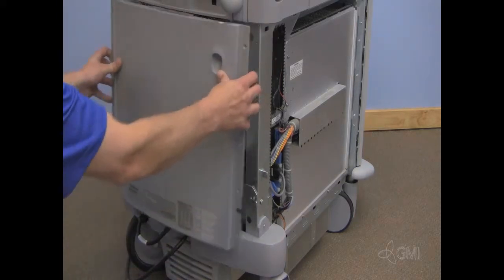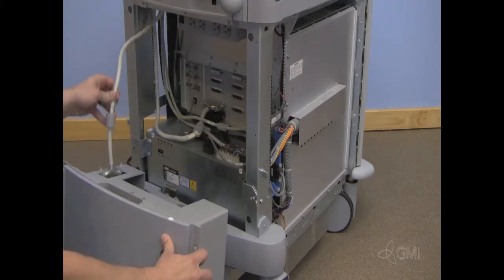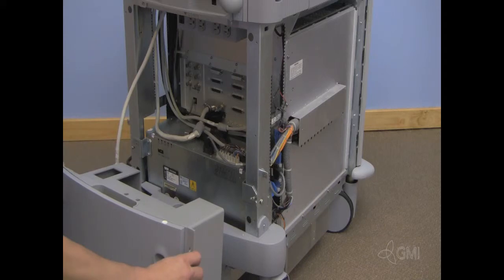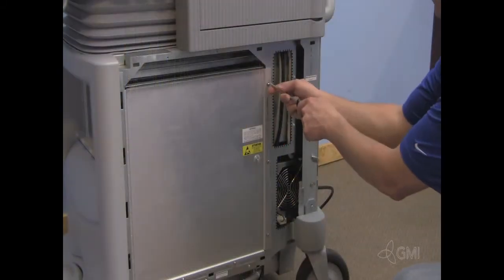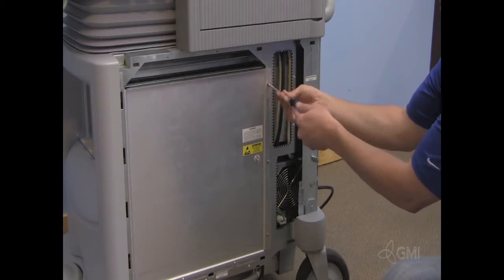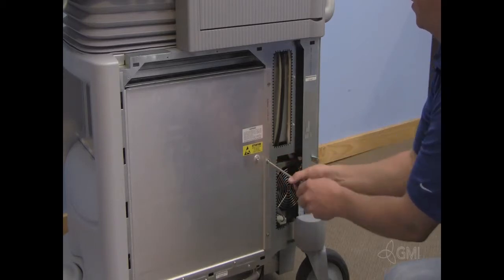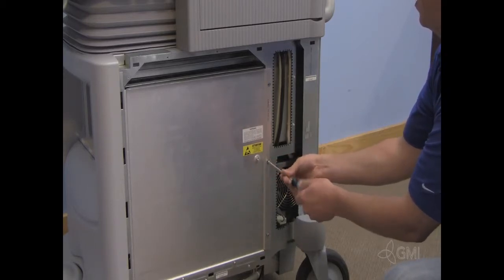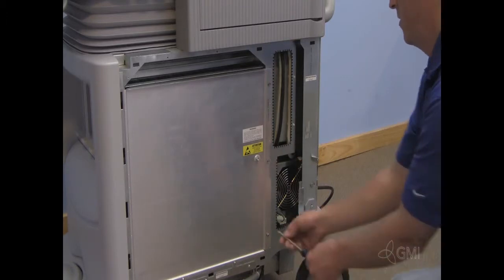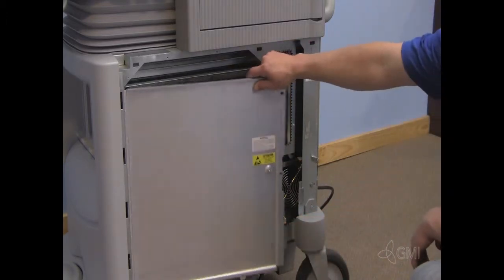Pull the rear cover out towards you. Feed the cable through the rear cover. Remove the screws from the card cage cover. Remove the card cage cover.